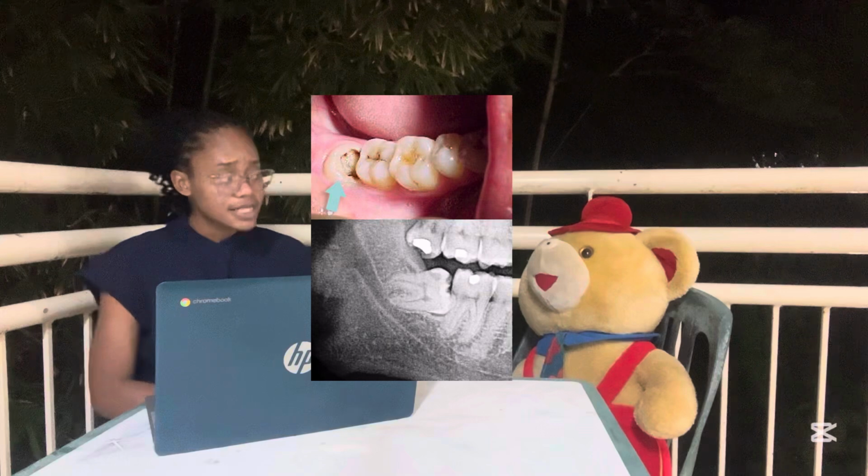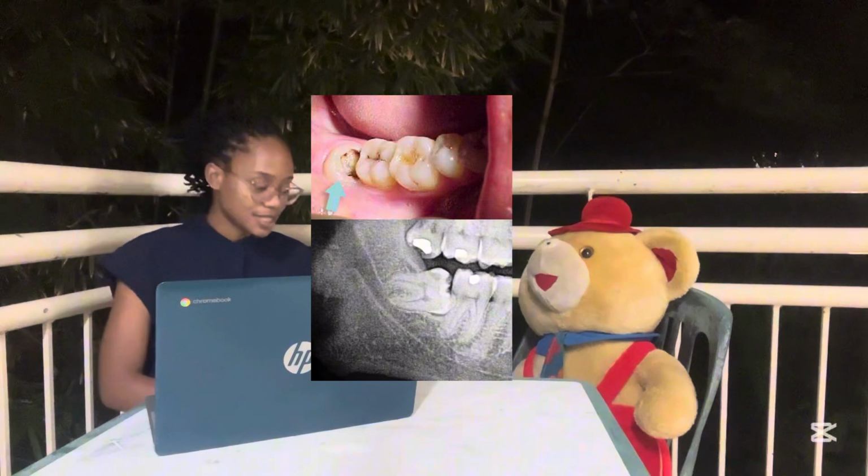Your presented complete history, as well as intraoral examination, has revealed a large carious lesion or cavity on your right lower wisdom tooth, which is most likely the cause of your pain and discomfort. However, I noticed that your wisdom tooth appears impacted, meaning that the tooth is not upright and or at the height of occlusion or level of the other teeth.